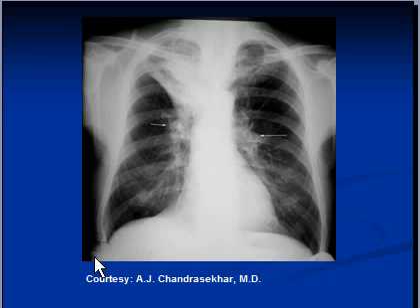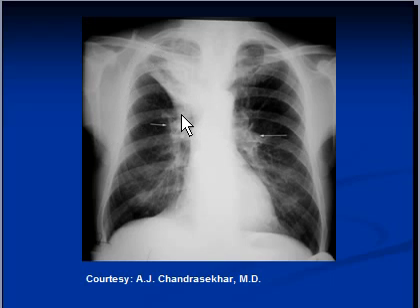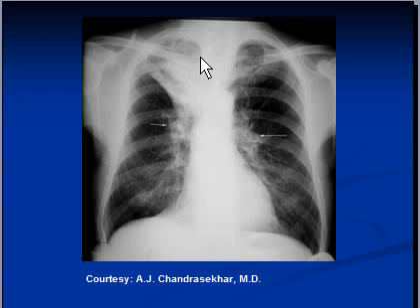Loss of lung volume, triangular opacity in the right upper zone, and upward pull of the hilum are signs of right upper lobe collapse. As the right upper lobe collapses, it decreases in size. Normally the right upper lobe occupies this region, but as it decreases in size it pulls the horizontal fissure, or minor fissure, upward creating a V shape. It also pulls the rest of the lung up.